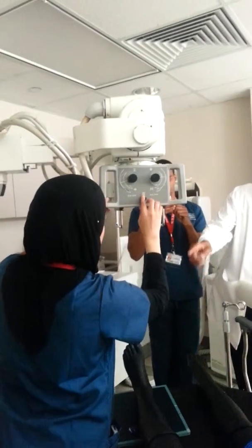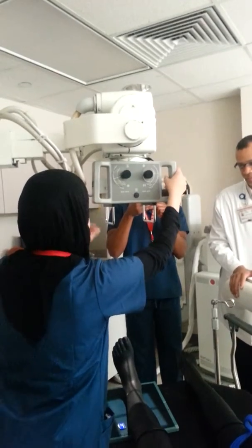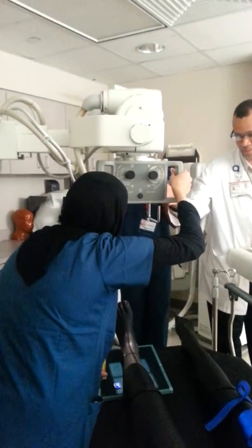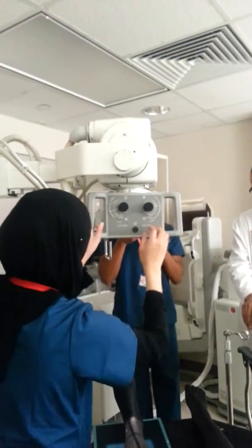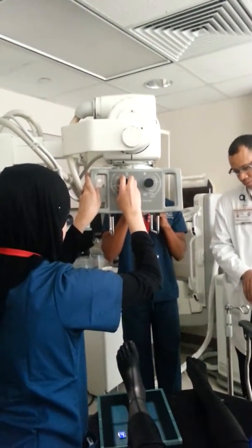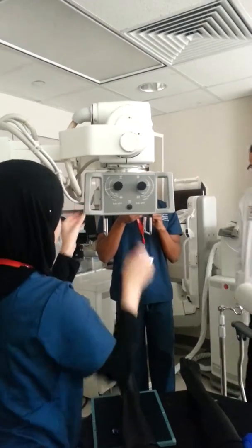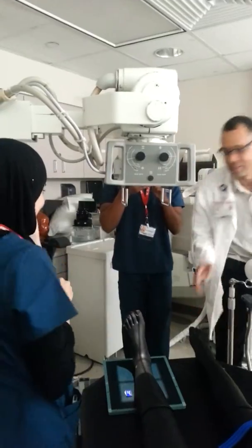Your tape measure. Oh, there's that too. Yeah, you measure that first. I'm nervous. This is the first thing. It's okay, it's all right. That's why you're here. So she's measuring the SID, going up to 100 centimeters. Now you just reset it. Go down a little bit lower. So there you go. That's good. Excellent. Okay, I just missed one part. All right, you step away so she can see.